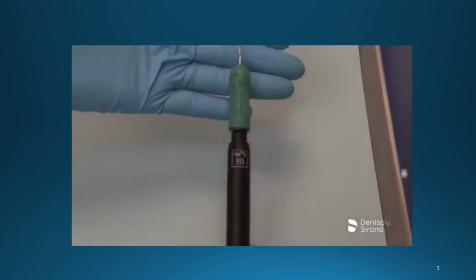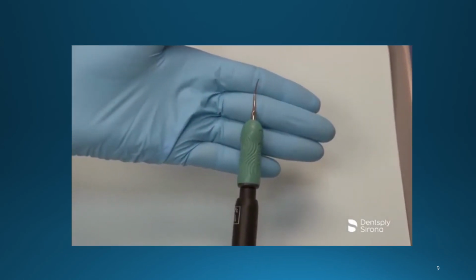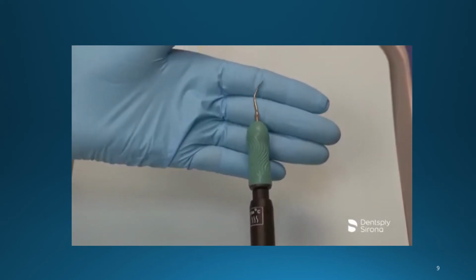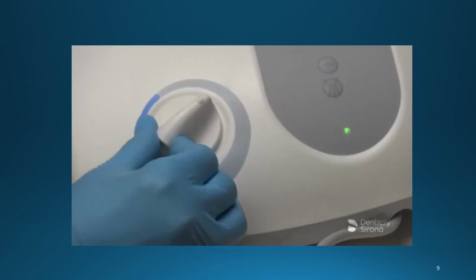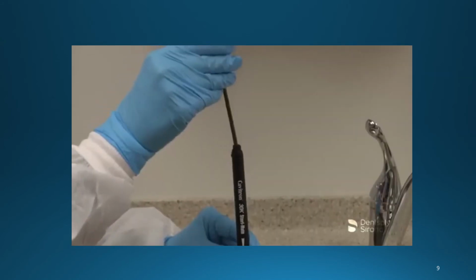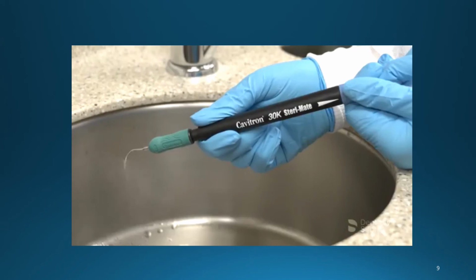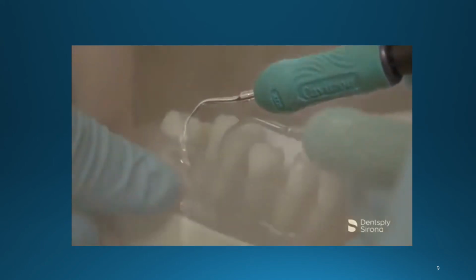This is the Cavitron FSI Slimline 1000. This insert combines a slim tip with a triple bend design with beveled edges, allowing for better adaptation around line angles and can be used at all power levels. After the clinician has filled the handpiece with water, seated the insert, selected the power, and adjusted the spray properly, instrumentation begins according to the treatment plan prescribed for the patient.